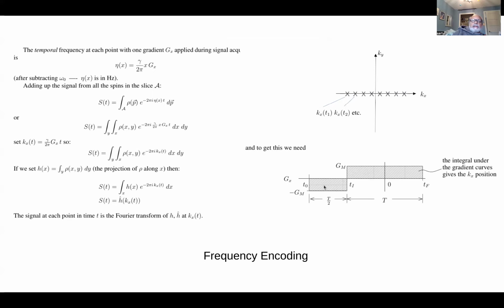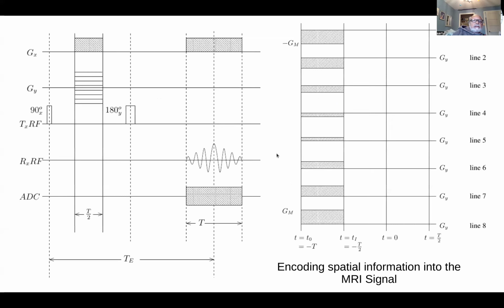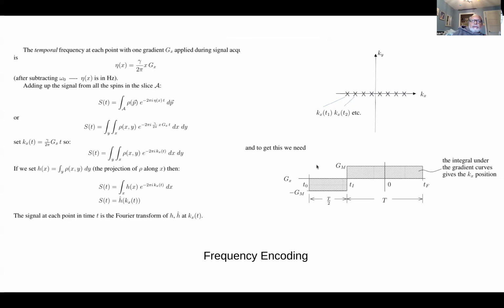And then we need this negative trajectory done actually before you do any ADC. And then with this on when you're collecting your ADC. So I think that's here. So the gradient is on at the same time as the ADC. And that leads to your different k-space.